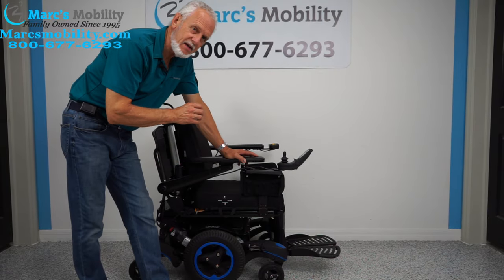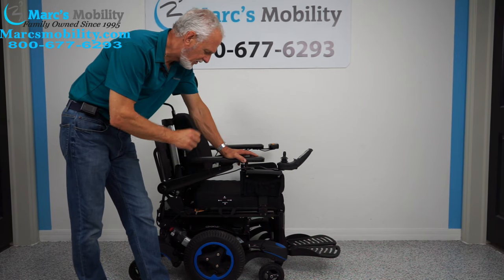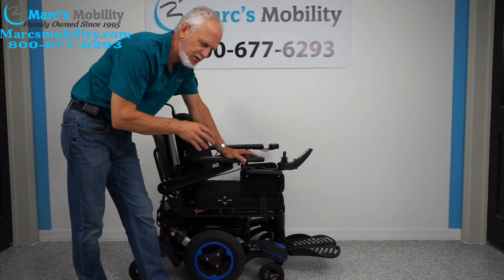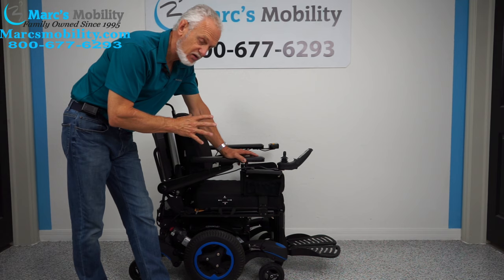We have here a Quickie 700M — M is for mid-wheel drive. This power chair is built like a tank. It's made by Sunrise Medical; Quickie is one of their chairs.